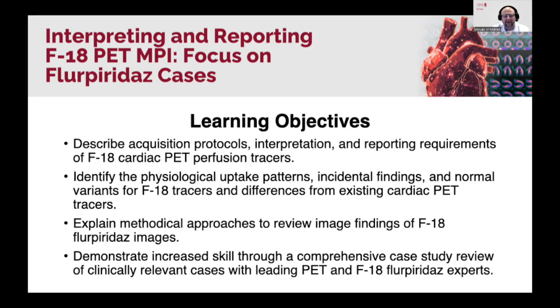For each case, the faculty will discuss uptake patterns, incidental findings, and normal variants seen with F-18 tracers and how they differ from existing PET tracers. In this session specifically, we will review these images using a standardized systematic approach and look at how these PET MPI cases will help you serve your patients and the clinical information you need to convey to your physicians.